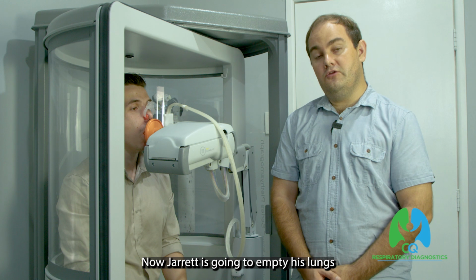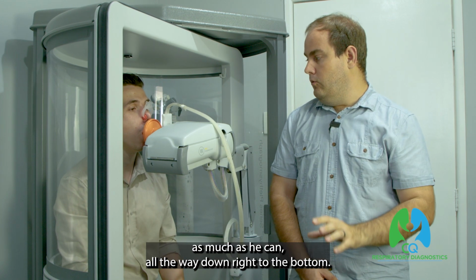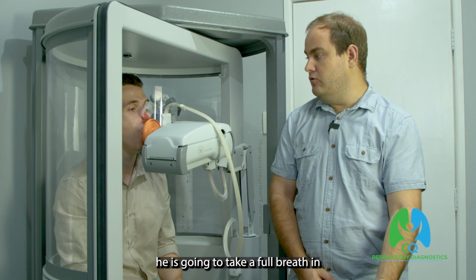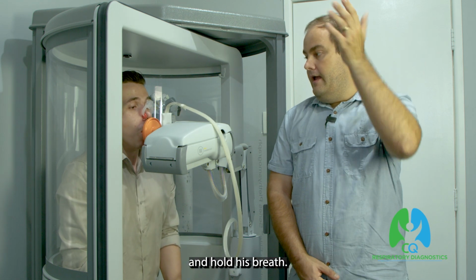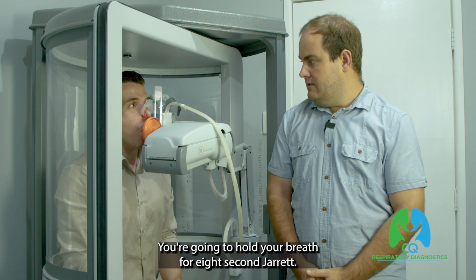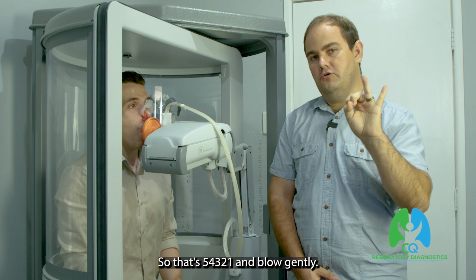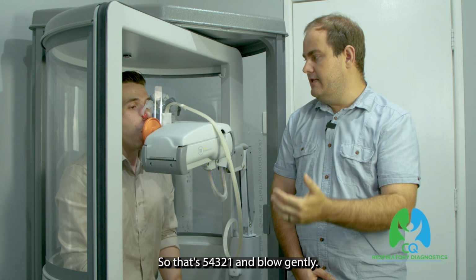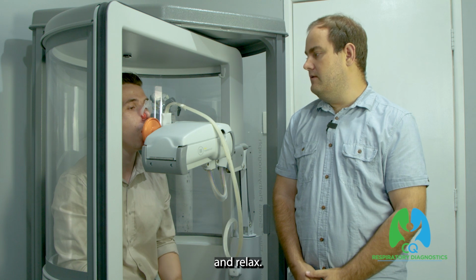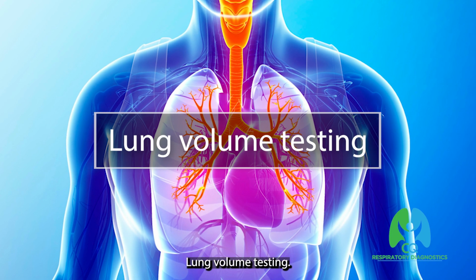Now, Jared is going to empty his lungs as much as he can, all the way down right to the bottom, and at the bottom he's going to take a full breath in and hold his breath. That's good. You're going to hold your breath for 8 seconds, Jared. So that's 5, 4, 3, 2, 1, and blow gently. Good. Keep blowing till there's nothing left and relax. That's all done.